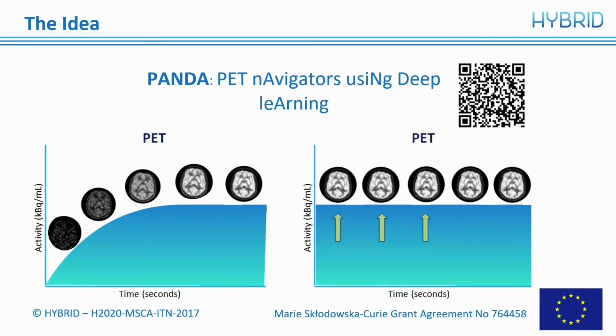By doing so, we achieve constant activity distribution over time in all series of PET images from dynamic acquisitions. We train the cGAN to perform the transformation, and we apply this module to a PET-CT system to register the processed PET images for motion compensation.